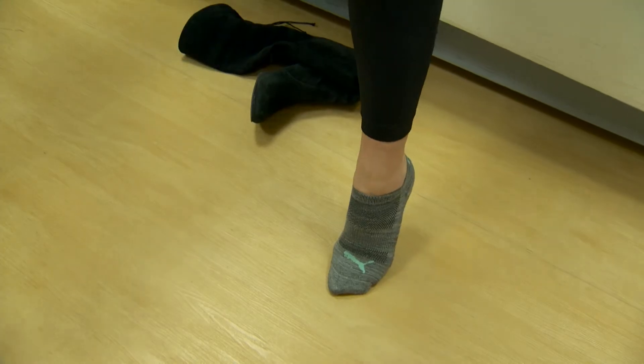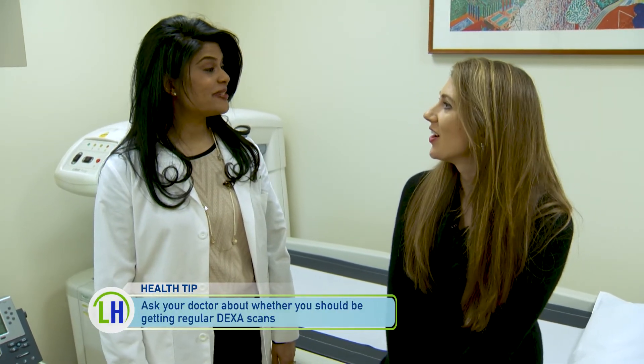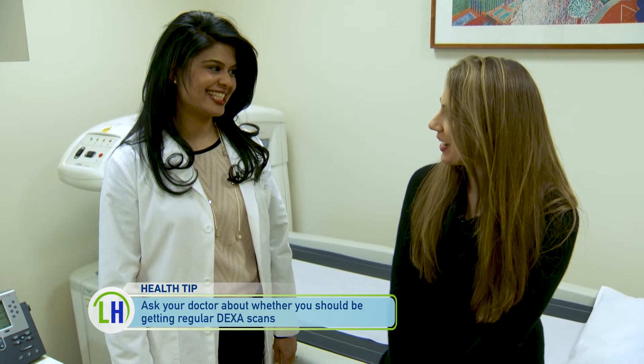Can I get on and try it? Sure. We're going to have Jason, our radiology tech, come in to position you correctly for the DEXA scan. Sounds good.